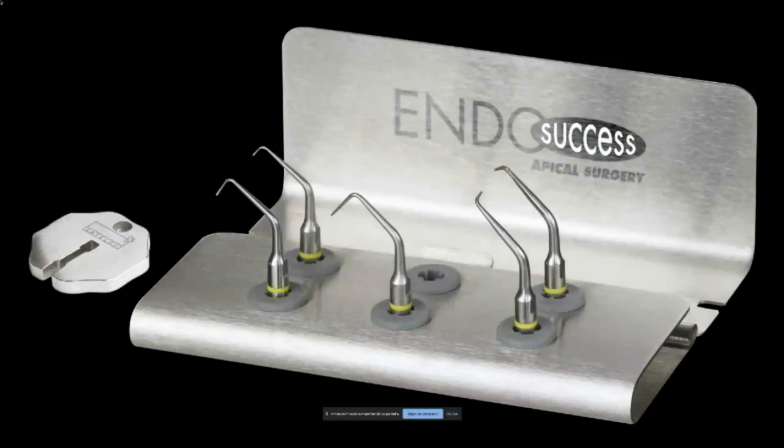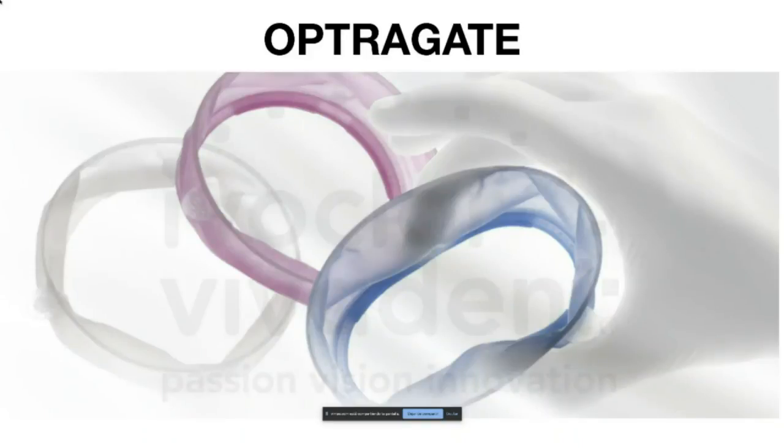Ultrasonic tips for apical surgery, and one of the ones that I like to use is this EndoSuccess apical surgery instruments. And I also always like to recommend to have something to separate the mouth or to open the mouth like a retractor. And normally I like to use the Optragate from Ivoclar because it helps me to open the mouth of the patient.